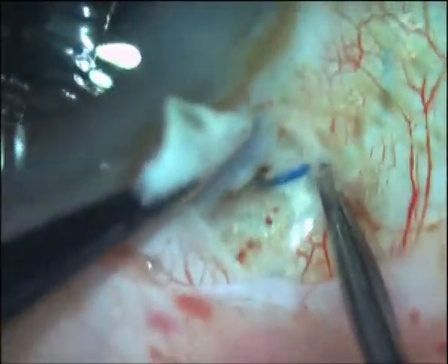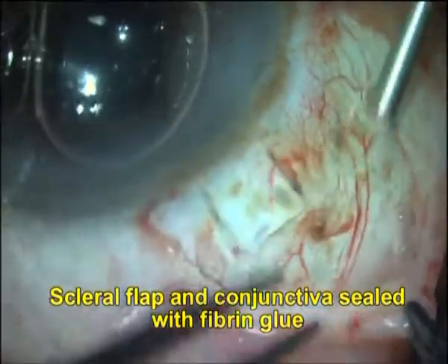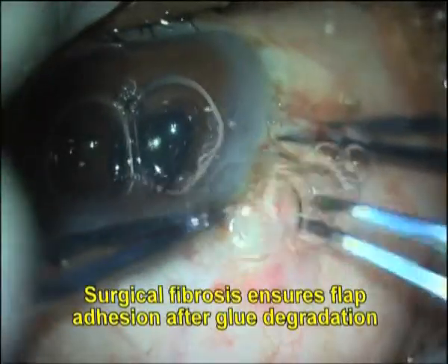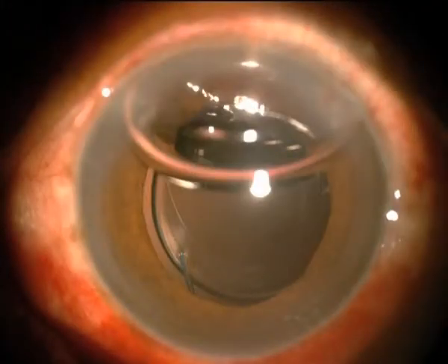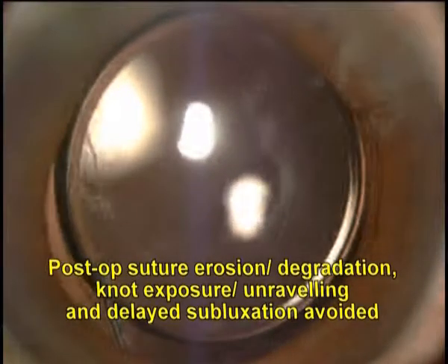Our experience with the glued IOL over the last four years, as well as that reported by Shariot et al., has shown that this material is biocompatible within the scleral wall and remains in place without any significant long-term issues. Elimination of sutures does away with all post-operative suture-related complications.